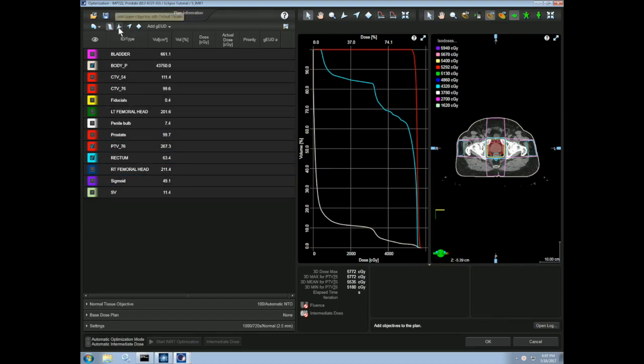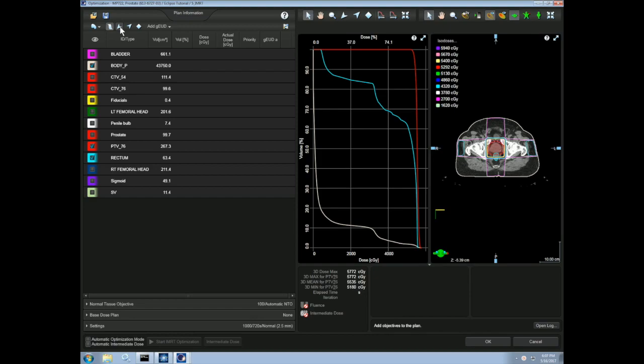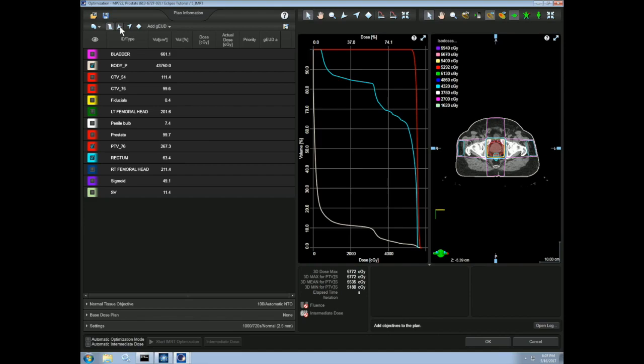An upper constraint is used for critical structures and the PTV and means that we do not want any dose greater than the specified constraint to cover a percent of the structure's volume. A lower constraint is used only for the PTV and means that we want at least some dose value to cover some volume of the target. We can also put a priority on each constraint, which will tell our planning system how heavily to weight the current constraint.